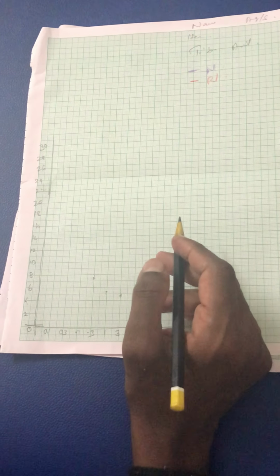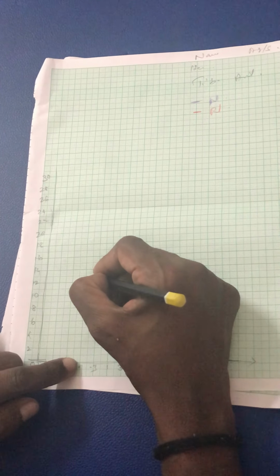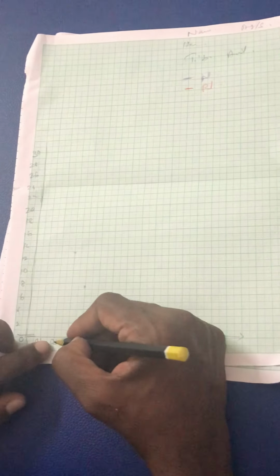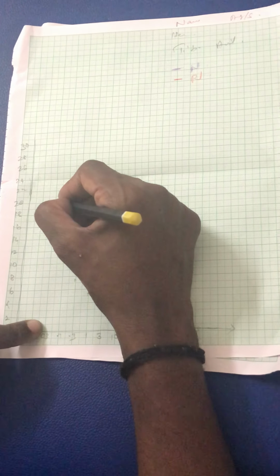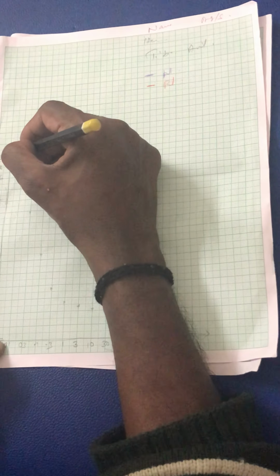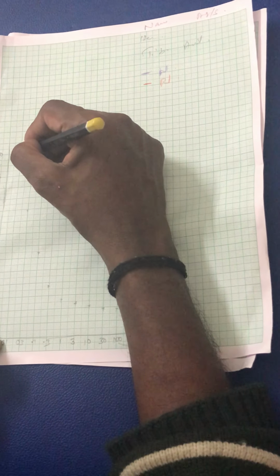Then 0.1 is 12.9. Here 12 and 14, so this is 13, and here I should place the value of 12.9. 0.03 is 19.1. This is 20, and less than that is my 19.1. 0.01 is 29.5. From here I am going up to 30, so 29.5. Okay, fair enough. Now I have pointed all the points.